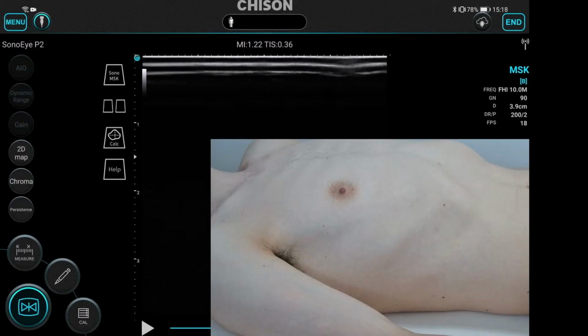thoracic fascial plane blocks. So we are planning to cover 4 thoracic fascial plane blocks which are frequently used. The first one which we will be using is the PEC block, which is like the PEC 1 and PEC 2 block. We will be covering the serratus anterior plane block, okay, SAP block, and then we will be covering the posterior ESP block, erector spinae block. So before we begin, let me tell you a little bit about these blocks.